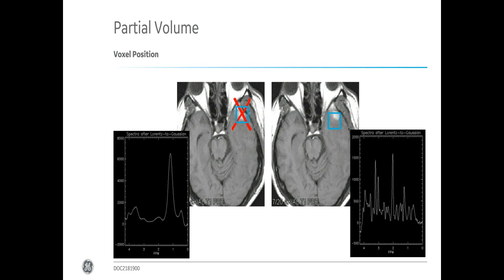Then we get what we call the partial volume effect. Only a partial volume of the structure you want to look at is within the voxel, so you also get signal from outside your lesion. For example, we would expect lower NAA in a tumor, so this NAA signal is more or less coming from outside, but the higher choline signal is an indicator for the tumor.